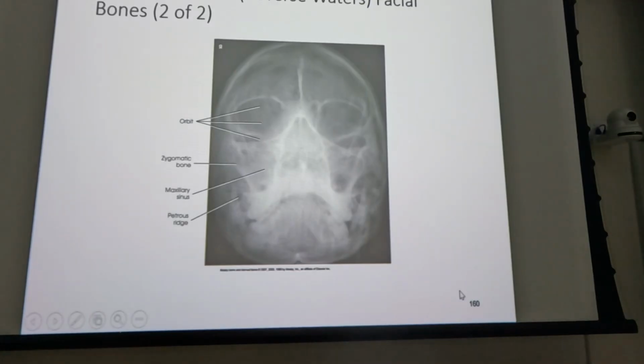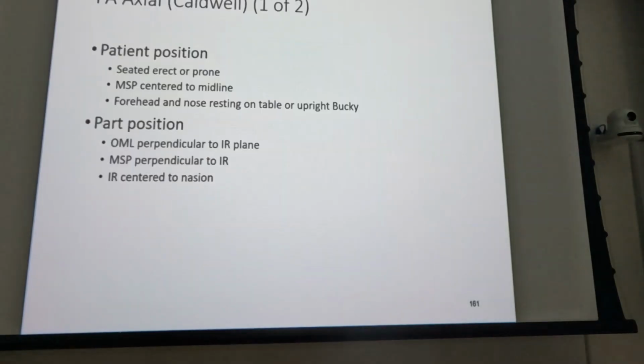The dens. In the dens. So this is either a complete internal decapitation or this is a Phantom, one of the two. And if it's a decapitation, I don't really know why we're looking for facial bones. The guy's dead. Right?